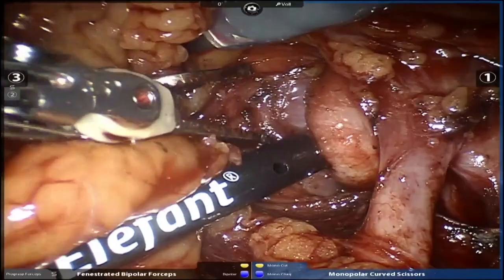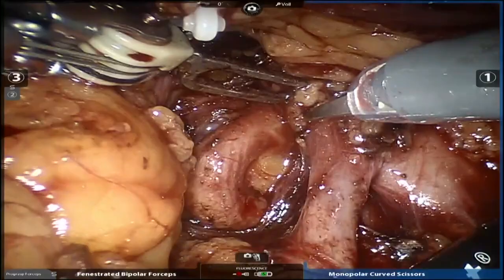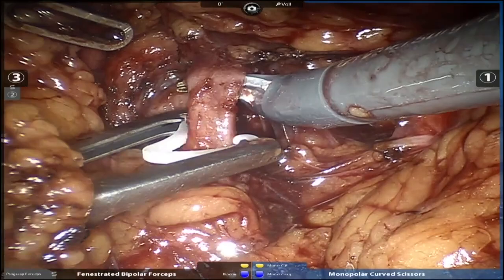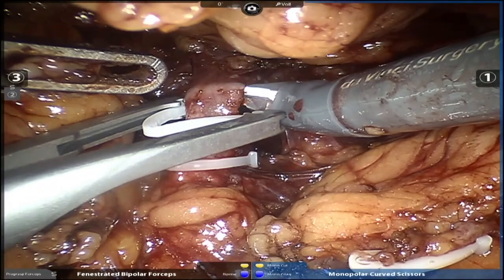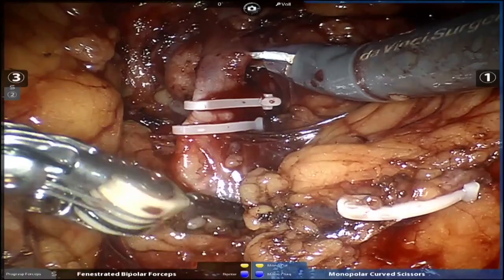Another vein here, too, apparently. Different? Well, it's good to discover that now, not in the case. That's a gonadal vein? This is a lumbar. Down, lower, Brandon, lower. Okay. Yeah. It's a lumbar. See, it's going back here. Have you identified the gonadal? It's going right down here. Yeah. Okay. See, this is a lumbar vein.